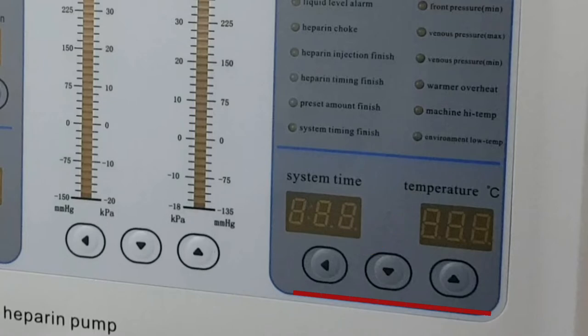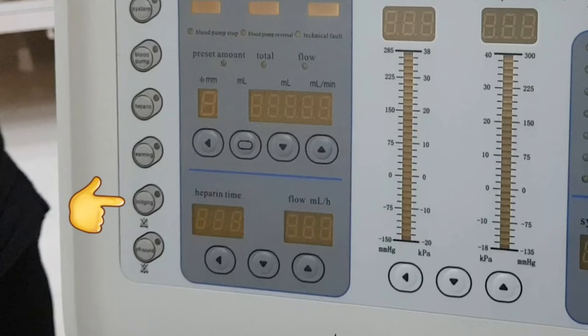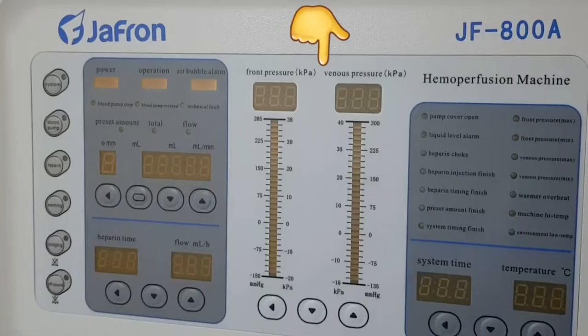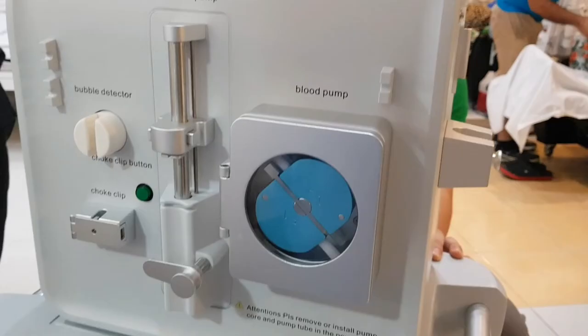The temperature can be set using the left arrow button and the up and down buttons. Bridging is used when transitioning to the next process, which is system off. The sound button simply mutes the alarm. The different alarms are displayed in this part so you are aware of why the machine is alarming. The center panel consists of the front pressure (arterial pressure) and venous pressure. The lower parts are as follows: chambers are located on both sides.